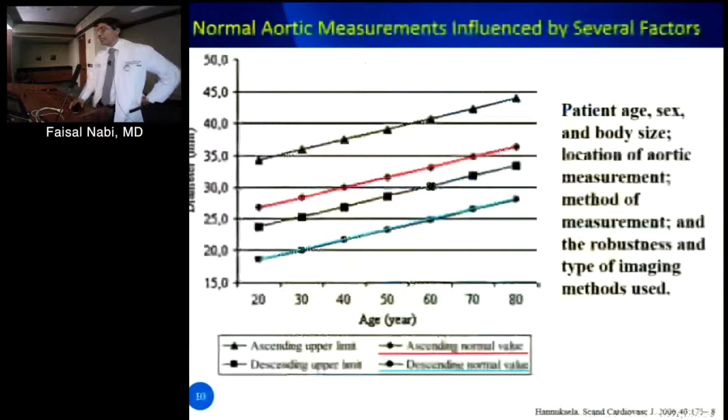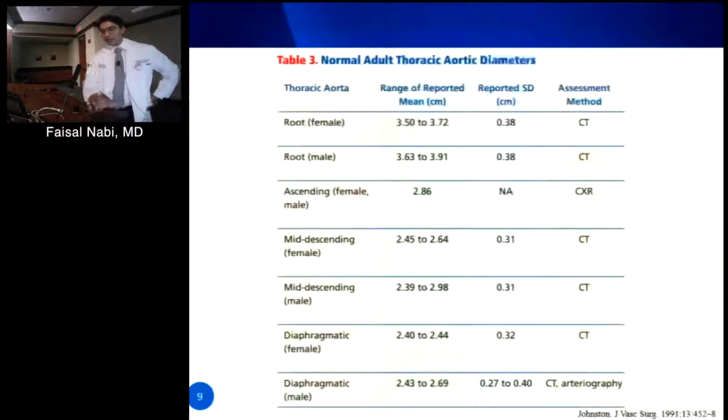So is this outside? Yeah, this is external to external.